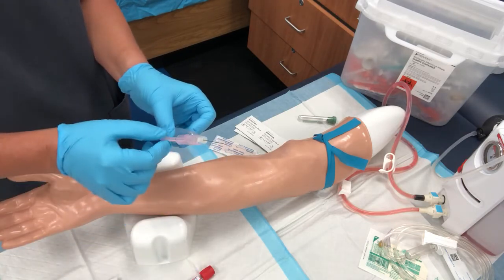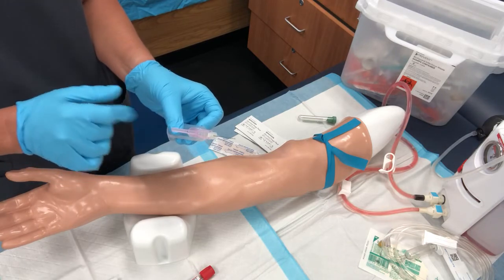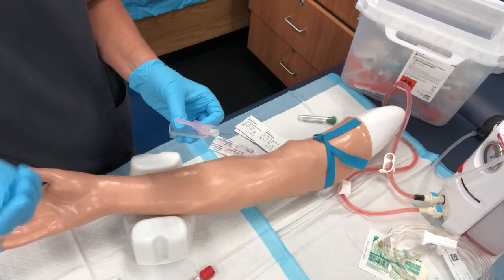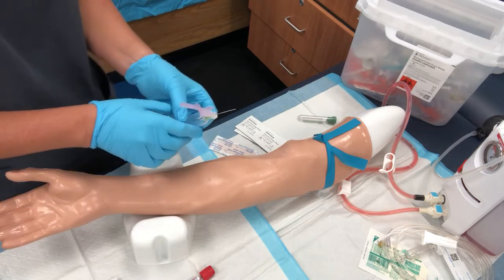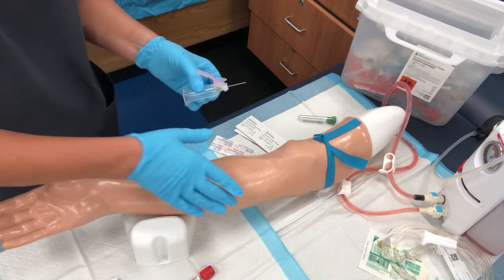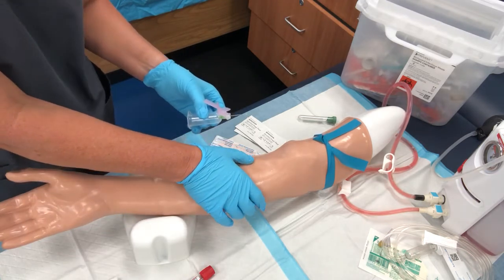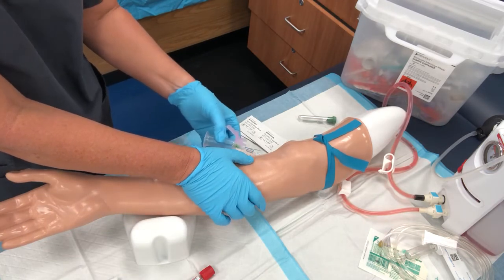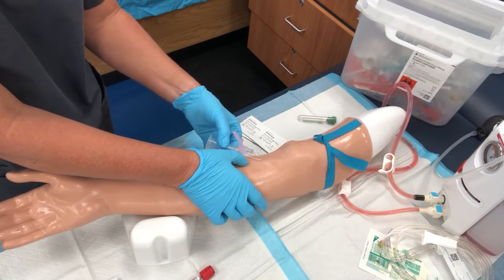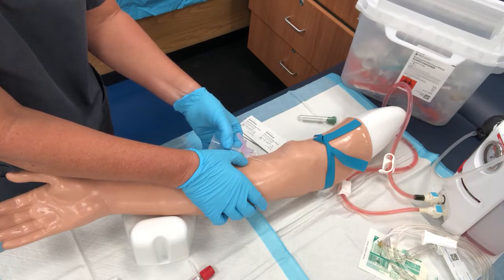Now again, very important, bevel up. You'll see a lot of people go ahead and pull the protective device away, simply because sometimes it becomes cumbersome. It's like right in your way. Now, I am left-hand dominant, so I'm going to take my right hand and I like to use my thumb and basically kind of pull down on the vein. And here's to hoping, I just put new tubing in these bad boys, that this is actually going to work. And so I'm going to stick it in.